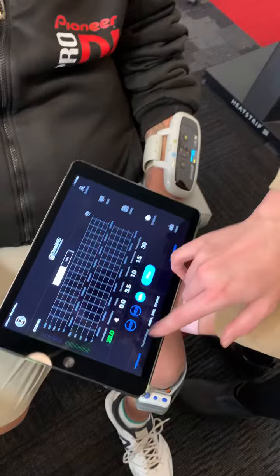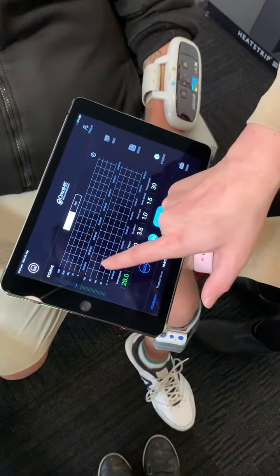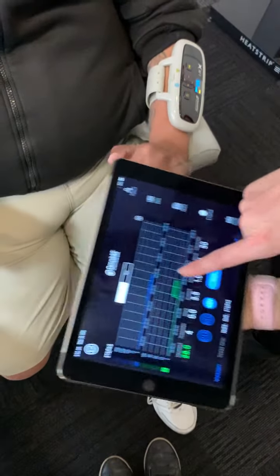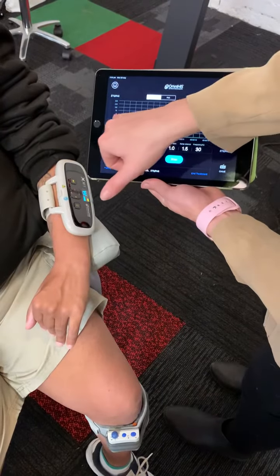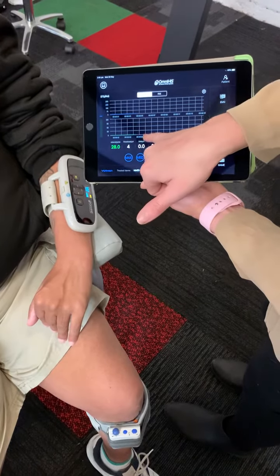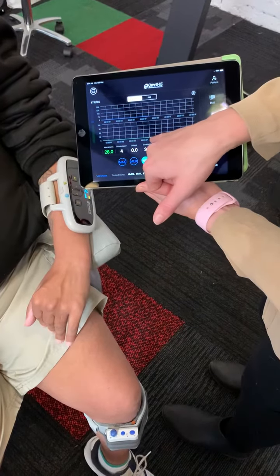We'll all watch this screen here. So this is Junior's stim — there's something firing and then it needs to produce enough stim to produce a movement. We've got some little flickers here, that's this little blue line flashing, but what we want to see is just a big pulse, and then it should produce another stim on the green line here.